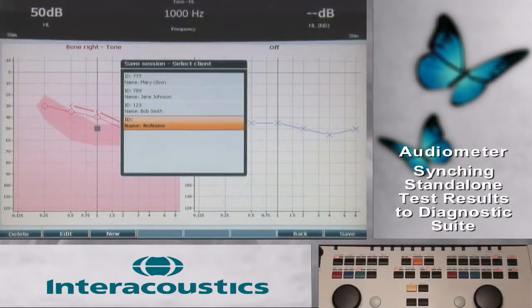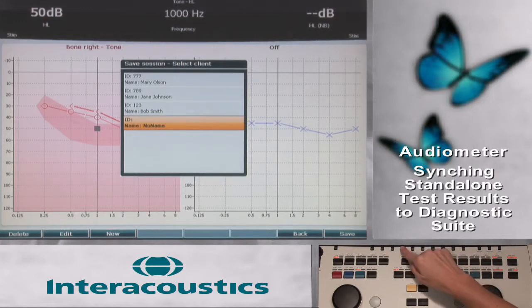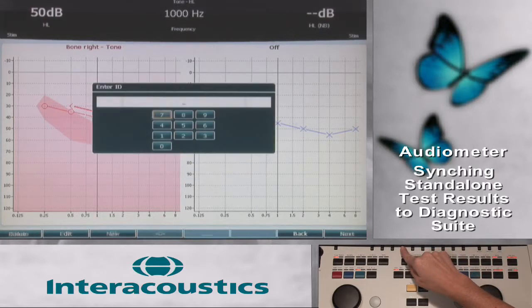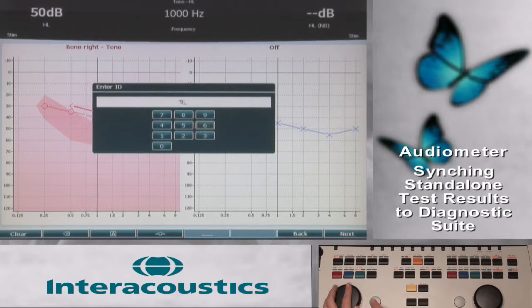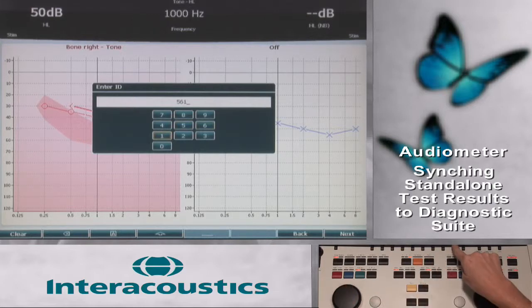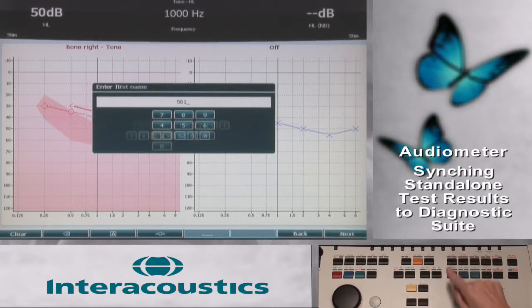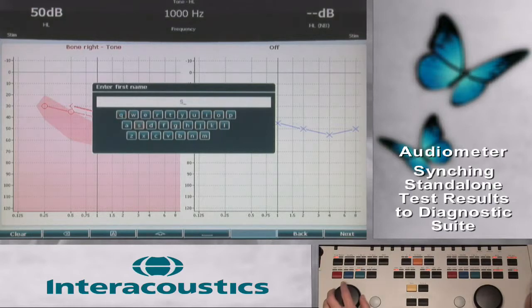A second way to transfer data is by first saving the client record in the audiometer and then transferring through the Sync tab. This can be useful when the audiometer does not have immediate connectivity to a PC. To review the saving of client records to the audiometer, return to the video tutorial series for selection.